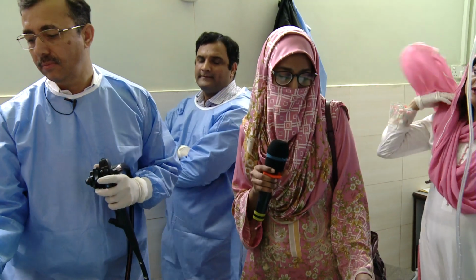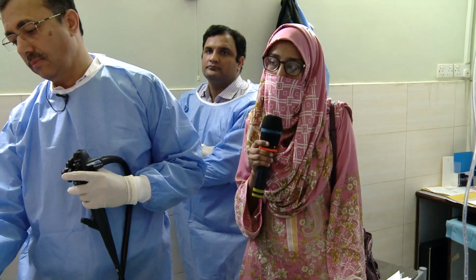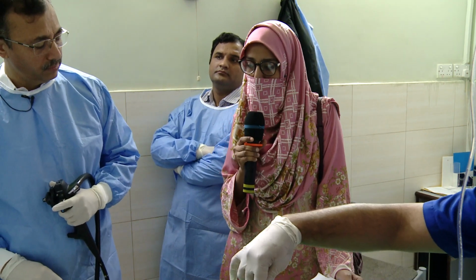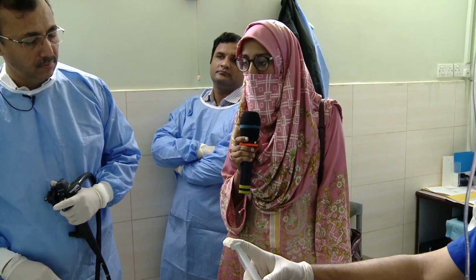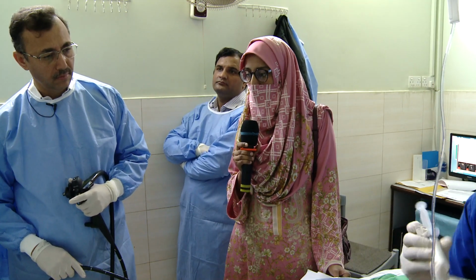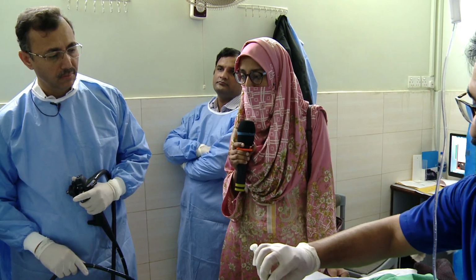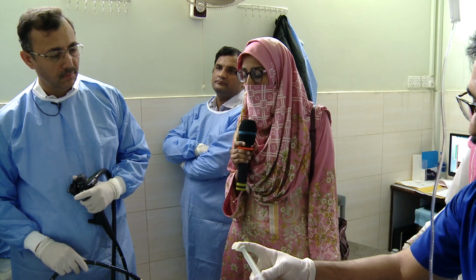Okay, so this is a 53-year-old male patient with no previously known comorbids who presented with a complaint of jaundice and weight loss history since 1 year. His ERCP was attempted 3 times in the year 2019. Each of them showed distal CBD stricture. Multiple attempts were made and a stent was placed. Currently, his CT showed a non-functioning CBD stent and features of cholangitic abscesses in the liver.